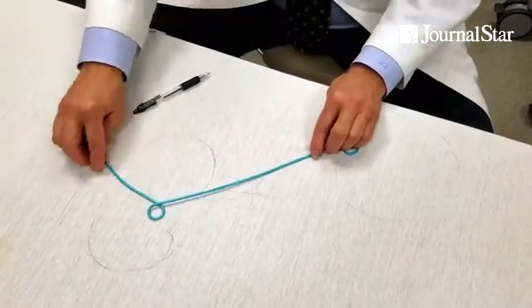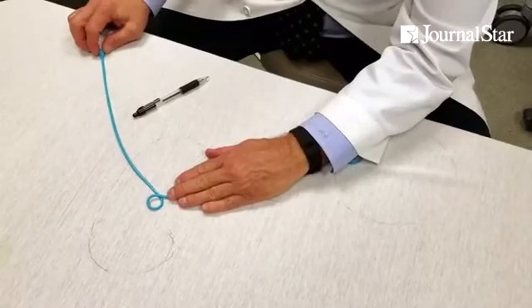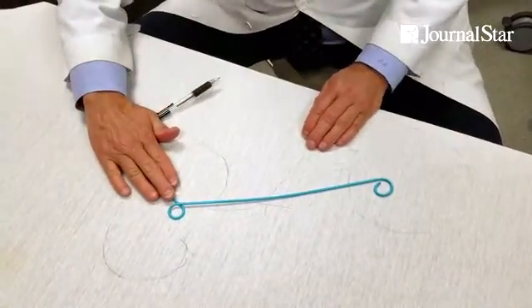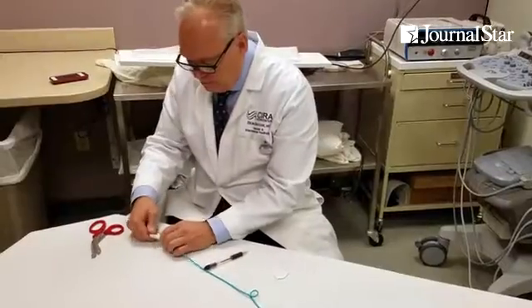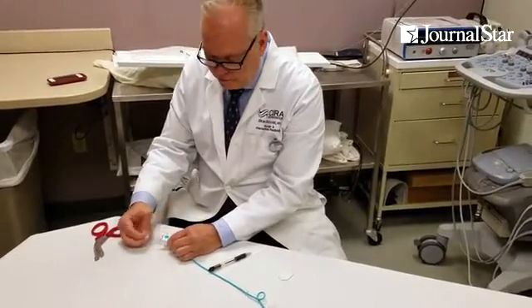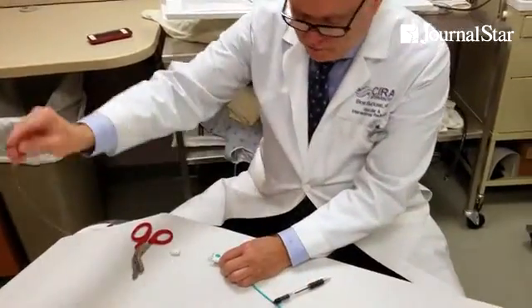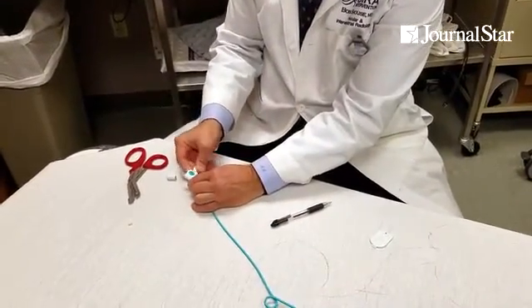On day one, we put a little drain into the kidney. Then on day three or day seven, we bring them back and put the internal part in — that's this. Very simply, this is a loop-forming suture. We take that out — that's what forms that loop in the body. And then when it's ready, just pull it apart and it detaches.